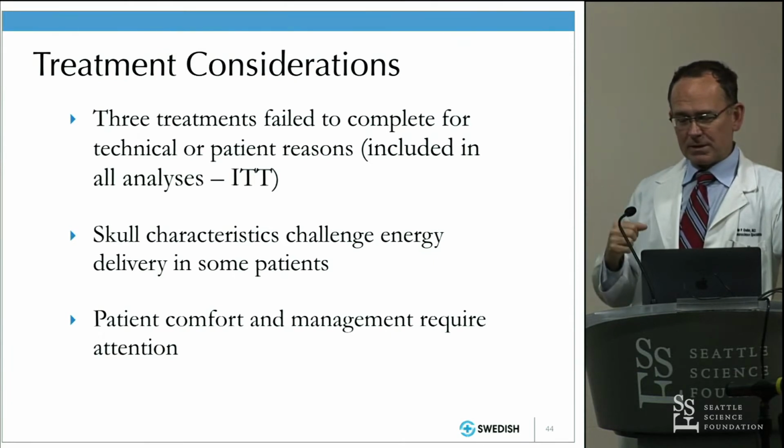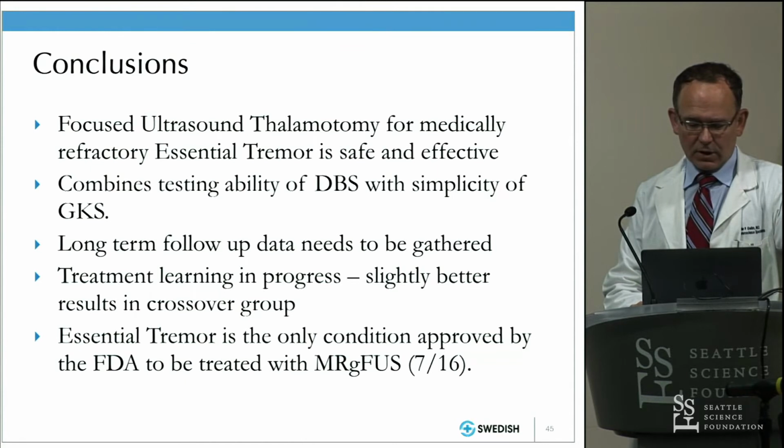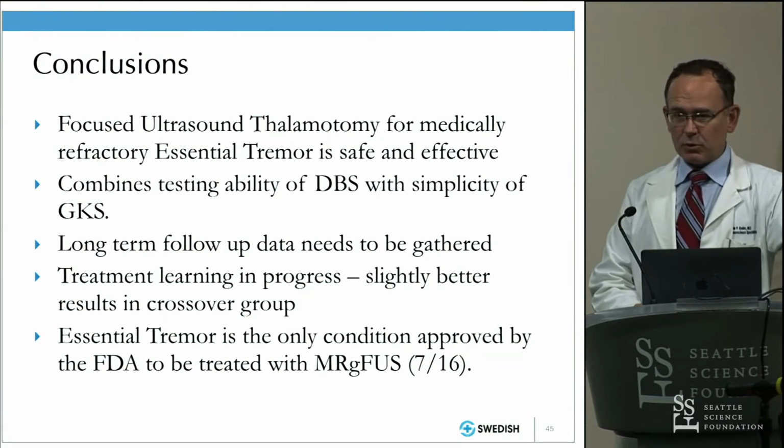And so we basically can't achieve a target temperature in some patients due to those characteristics. And there were patients that simply could not lie flat for long enough to have the treatment done. So essentially it was approved by the FDA in July of last year. There is an ongoing study. There was an open label study that has closed now, and there's a post-market study that is going on as well. But clearly it is effective at least up to a year out.